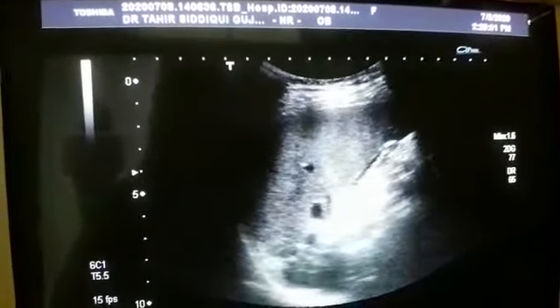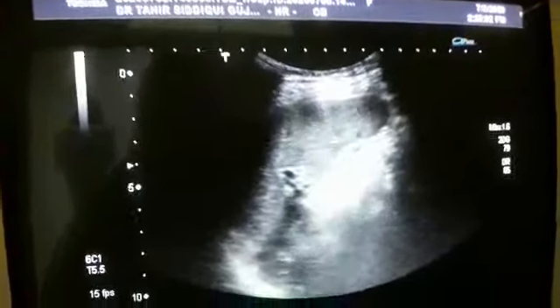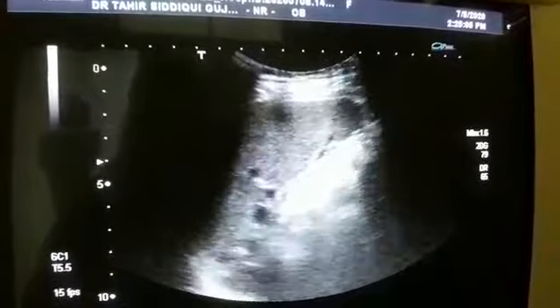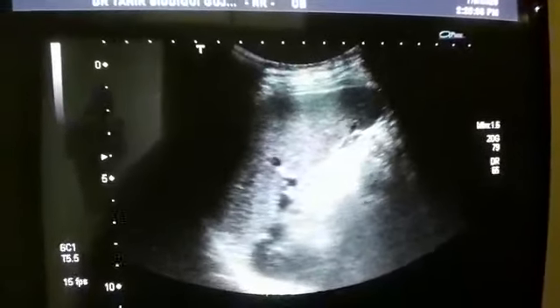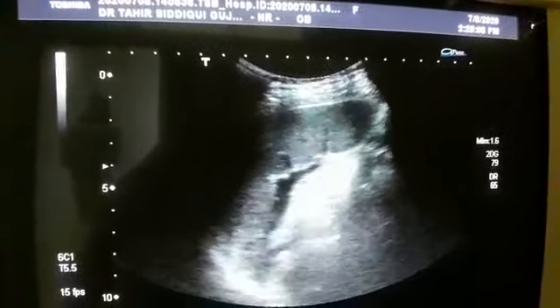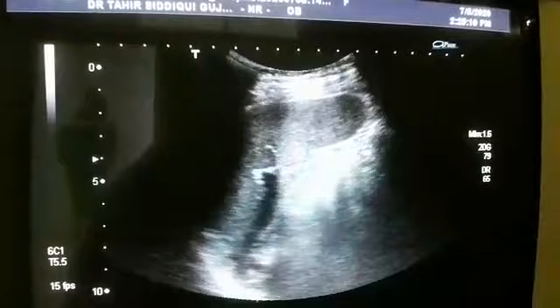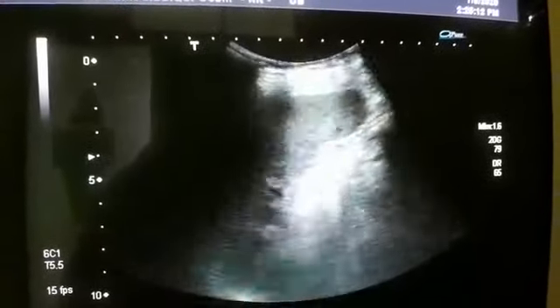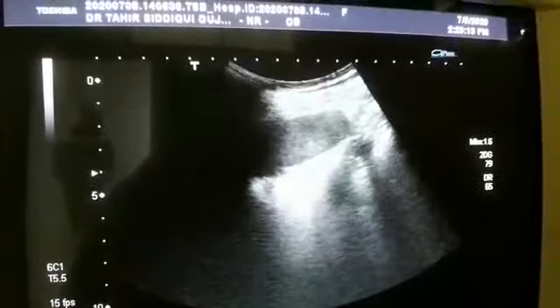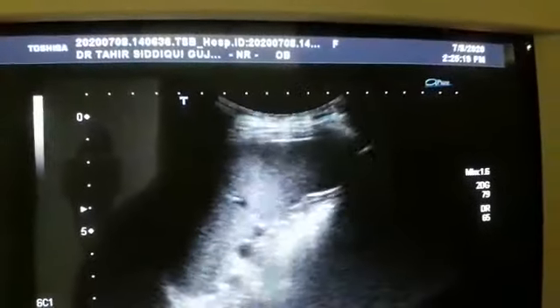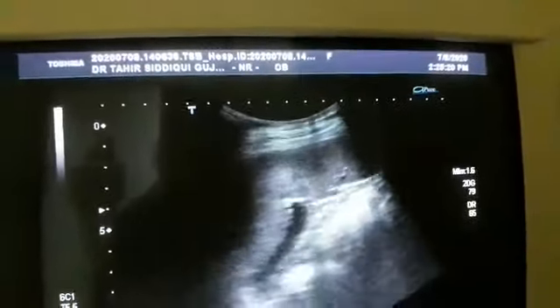Multiple congenital anomalies you will see. This is the left side and we are seeing the spleen, and what is noted is that the left kidney is absent. We do not see the left kidney in its normal lumbar location.